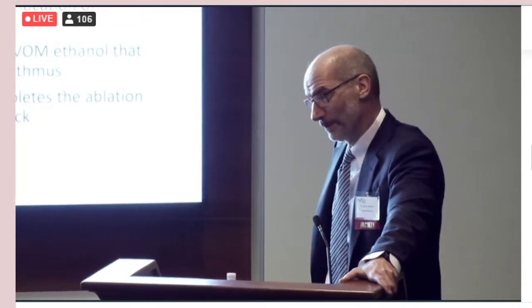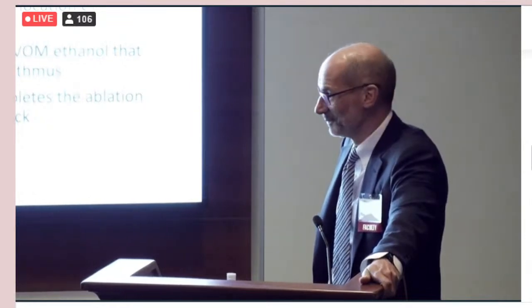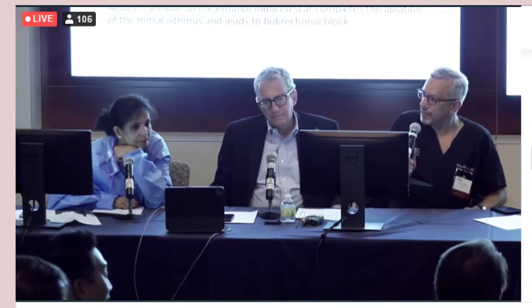They're almost ready for the micro, but there's an online question. I just want to get through that real quick, and then we're going to move to the live case. The alcohol seems to be very caustic. I've experienced difficulty pushing contrast through the catheter after the first injection. Have you experienced this? How do you circumvent this?